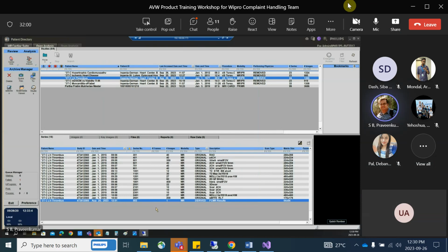Is that clear? No, it is not clear to me. I'm asking again. Imagine I'm a radiologist and I want to perform one task: someone has given me an MR perfusion order. I do the scanning, and the scanning gives me the raw data. The raw images are in the PACS. Now my objective is MR perfusion or MR diffusion.